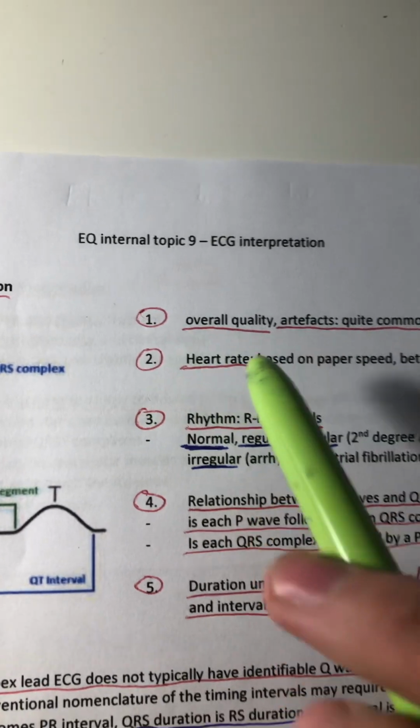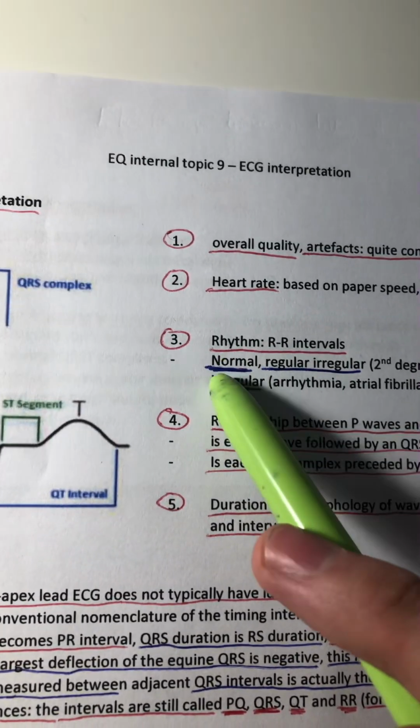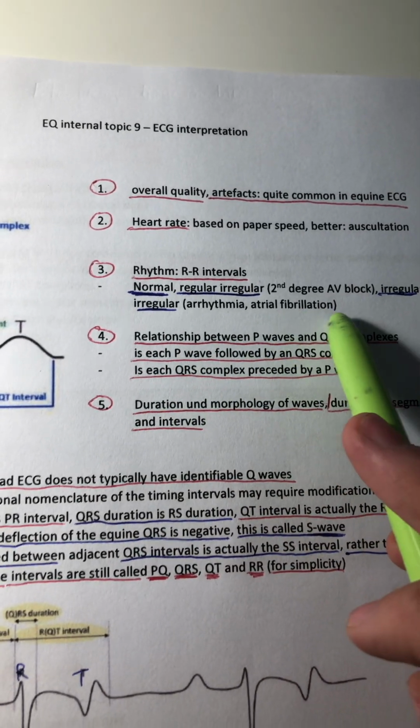The basic steps of interpretation. Number 1, the overall quality. Artifacts are quite common in equine ECG. Number 2 is the heart rate. Number 3 is rhythm, the RR intervals. You can have normal, regular, irregular, such as arrhythmia or atrial fibrillation.